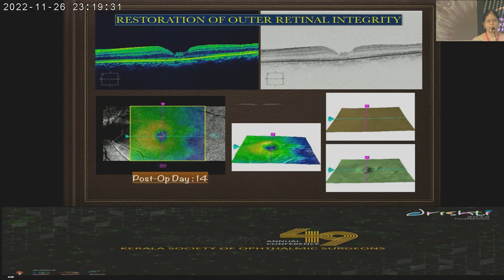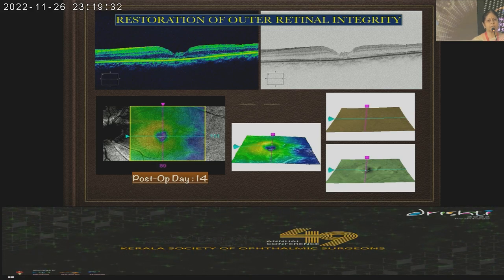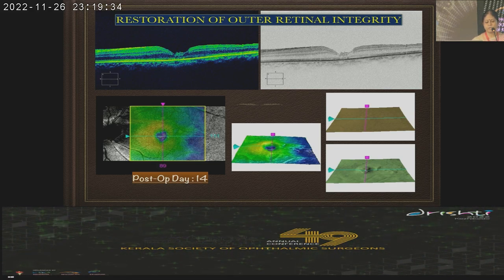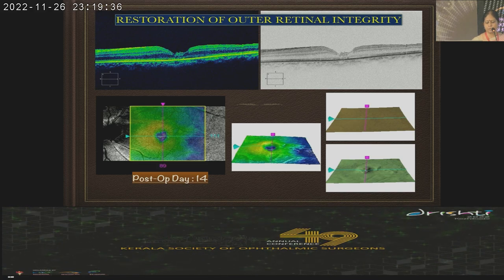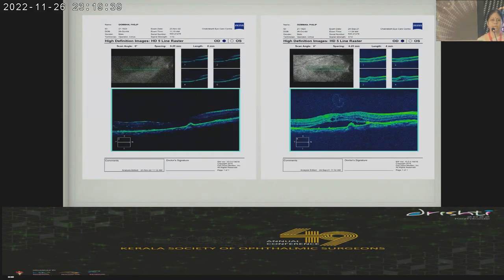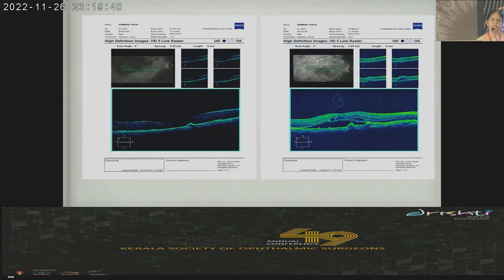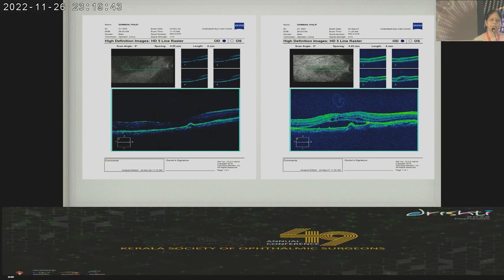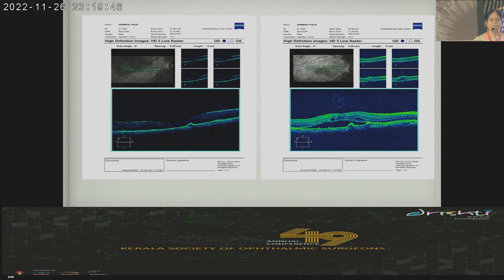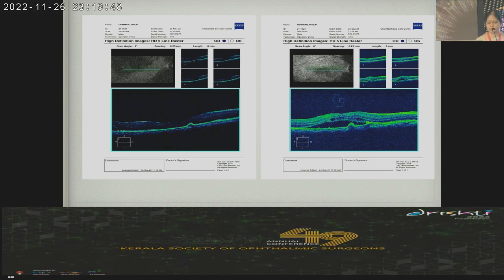This is a huge macular hole — you can see the stuffed tissue. He did quite well, but on follow-up he had recurrence of the pathology — a choroidal neovascular membrane responsible for the subretinal blood — six months down the line, and he is now getting injections for that.